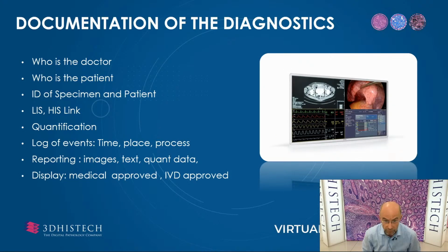And these are the new steps that the previous predecessors of digitization already opened for us, that we have to be able to add, to save, to recover who is the doctor who cares about the case, who is the patient, and the identification of the specimen and the patient data integrated in this hospital information system, opening opportunity for quantification and logging of the events, which were already developed, especially in radiology.